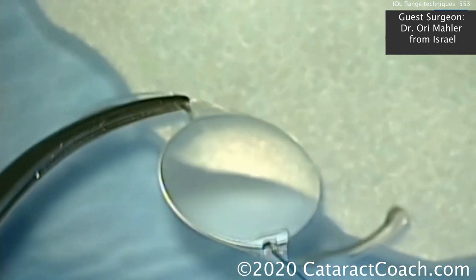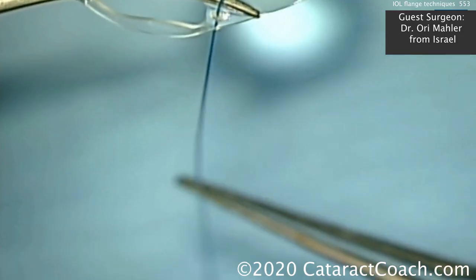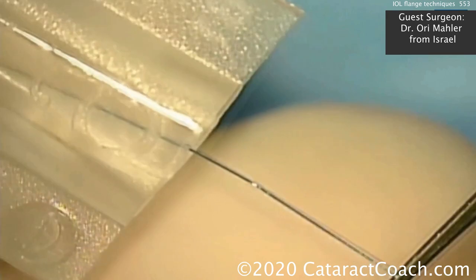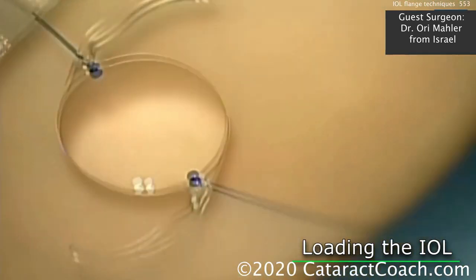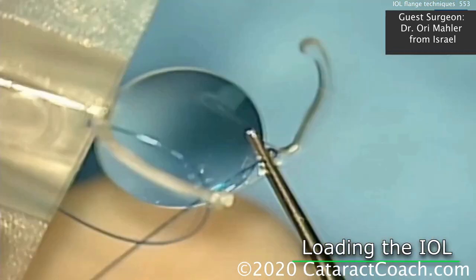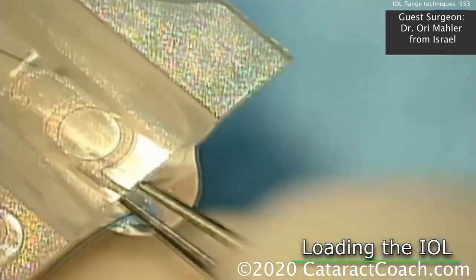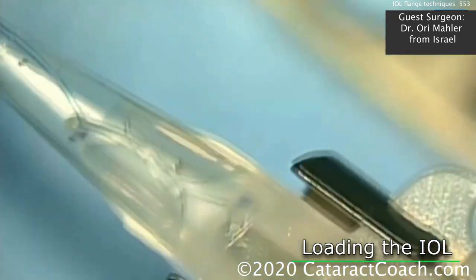Do the same thing on the other side as well. The haptics in this case aren't going to do a whole lot, so some people even amputate the remainder of the acrylic haptics — either way is okay; in this case, leave them intact. Filling up the cartridge with viscoelastic, then placing the leading suture down the barrel of the cartridge. Remember the anti-S orientation, so flip that upside down — perfect. Load the lens into the cartridge. This is a D cartridge, so it goes through a 2.4-millimeter incision. There's the trailing haptic and the trailing 6-0 prolene suture.